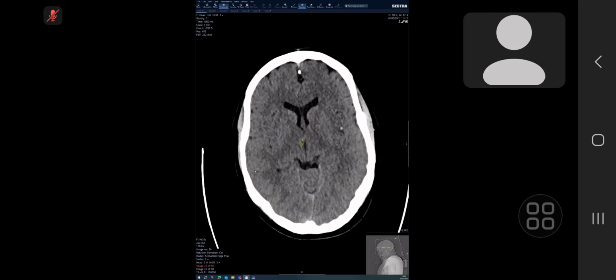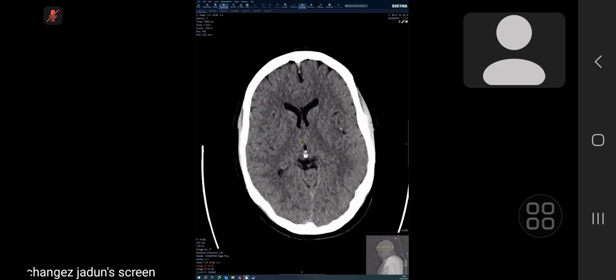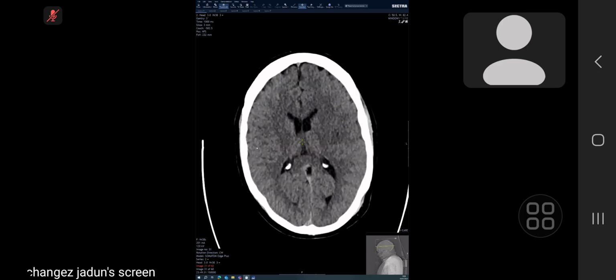Yeah, here, stop, please. In the left cerebral hemisphere, lateral to the basal ganglia in the region of the insular cortex, I can appreciate a central dot-type hyperdensity which is not on the right side. So it can be a blood vessel in which there is a thrombus.